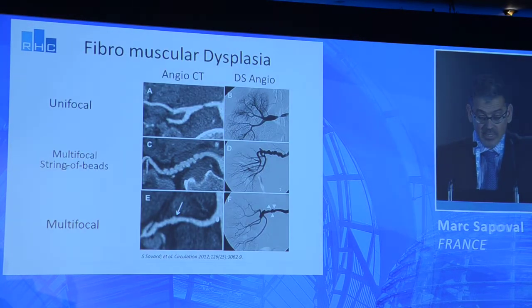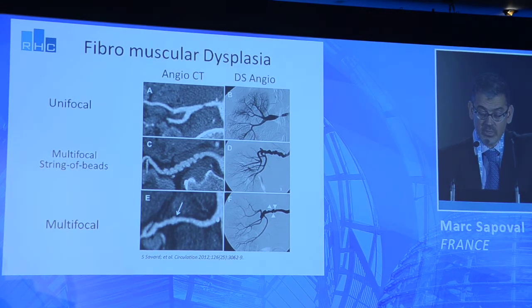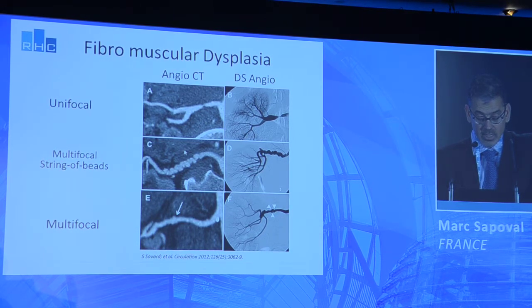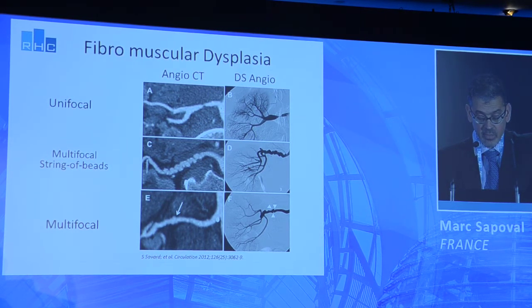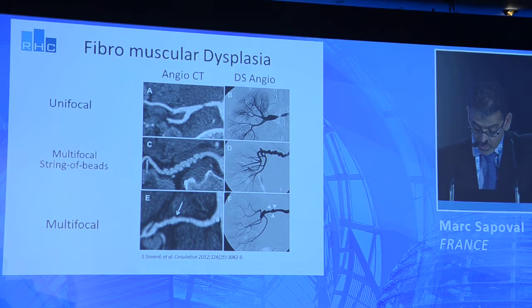It's the best technique. So again, the same slide: unifocal, you can measure the stenosis relatively easily with both techniques. This is CT, and again, multifocal string of beads, very difficult to assess if there is a stenosis here on CT, and not so easy on angio as well.